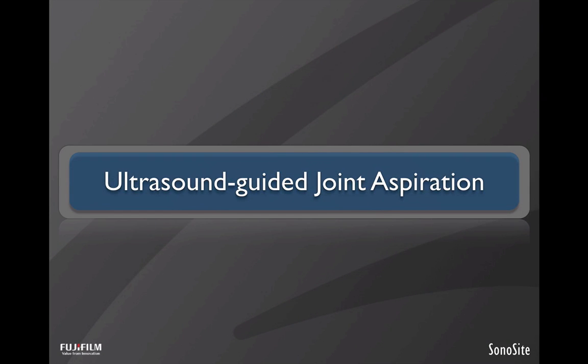So let's move on to something that's even more important to me on a daily practice level: ultrasound-guided joint aspiration. The reason these are so important is, along with guiding me into the space when I see an effusion, it also tells me in patients that have red swollen joints, no, you don't have an effusion. And I don't need to tap it because I don't see a large effusion in that space.